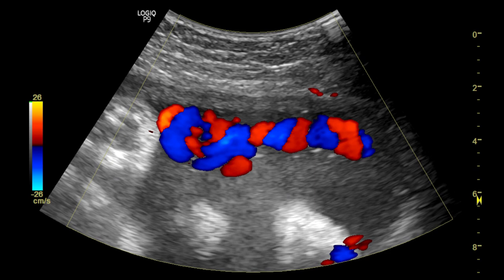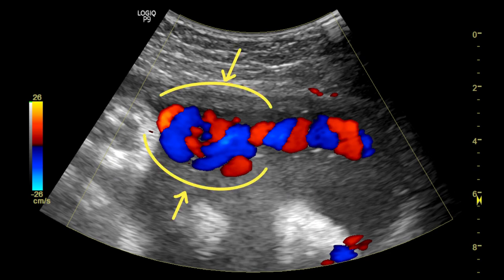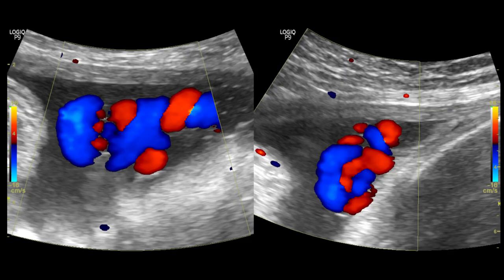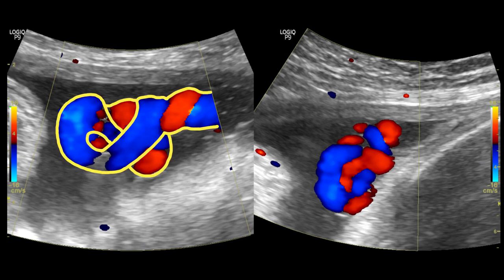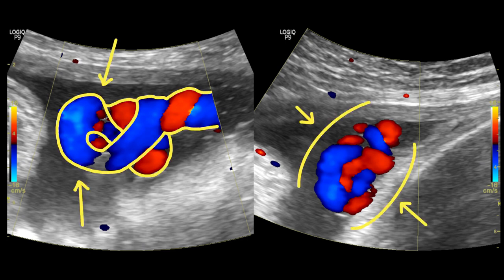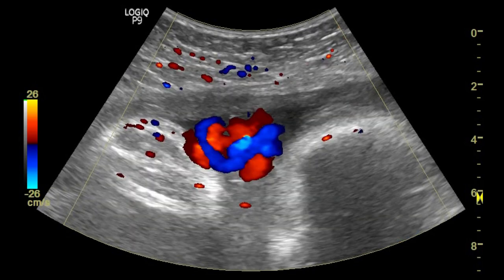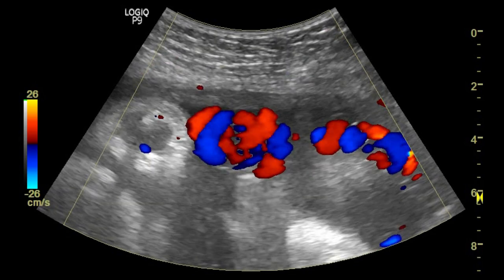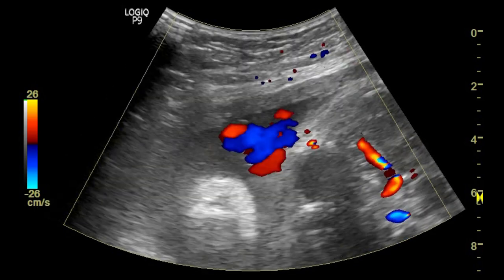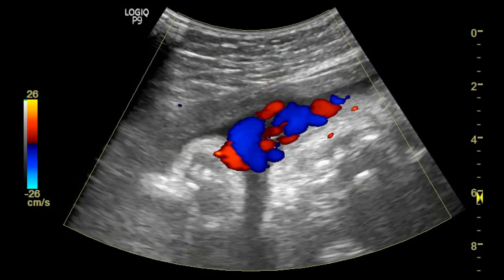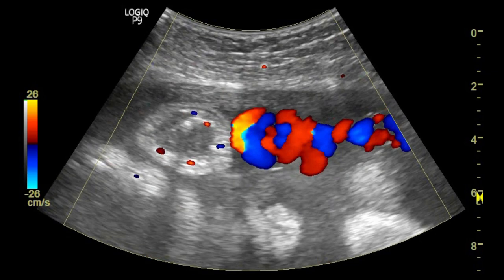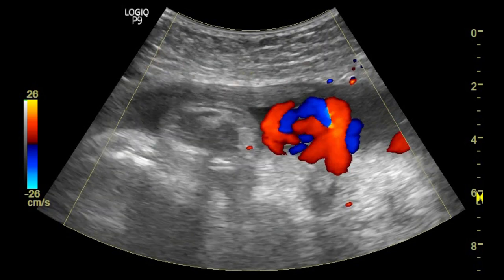Here you can see the color Doppler image of the umbilical cord. This part represents the umbilical cord knot. It's usually a risky term to use on your report because it has a high false positive rate, but here you can see there is a mixture of the vessels at a point, and this is the umbilical cord knot.